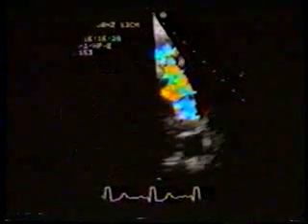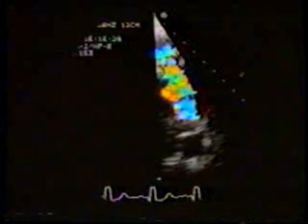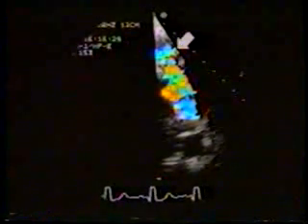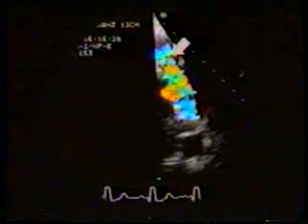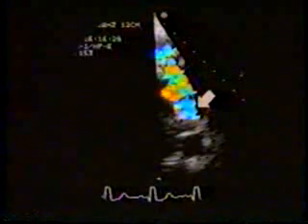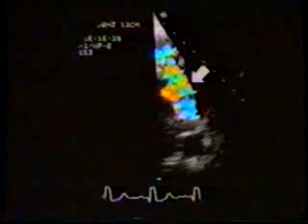In this patient, even though 2D echo allowed fairly good visualization of the conduit valve stenosis, color flow imaging enhanced the visualization and appreciation of the stenosis further. Note here is the level of valve obstruction, and we see a very nice mosaic color jet entering into the distal portion of the conduit in this area. We'll visualize this in real time now.